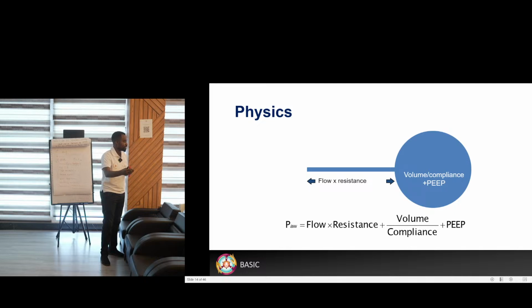Yes, that's where you put a hold. So the vent will measure the pressure at the end of the respiratory hold. The pressure inside the alveoli will be your plateau pressure.